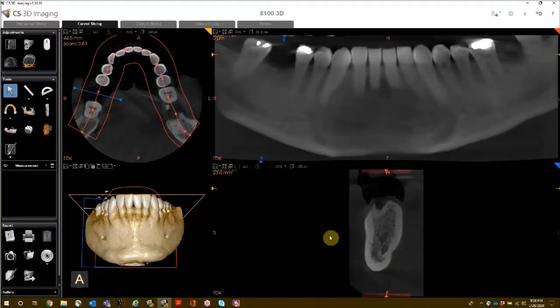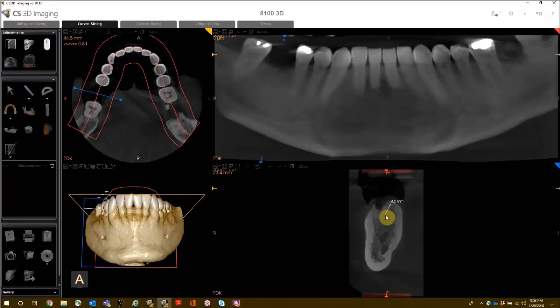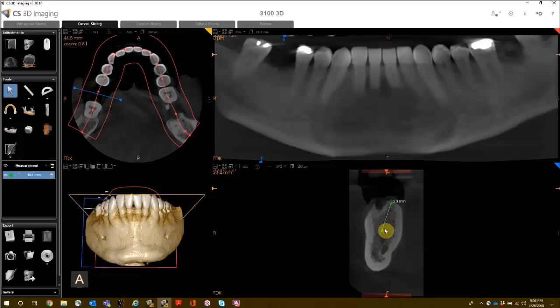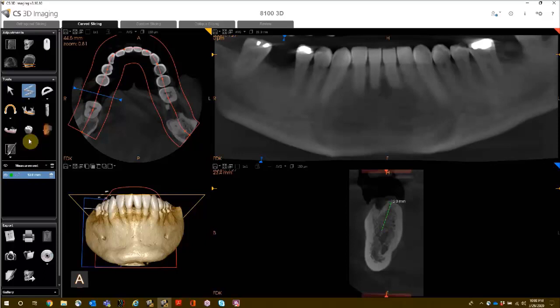Performing measurements. To perform a measurement, activate the measurement mode in your tools. Single left-click where you want to start and single left-click at the end. The drop-down arrow under your measurement gives options for multiple measurements, multiple measurements without having to reactivate the measurement tool, as well as a polyline measurement.